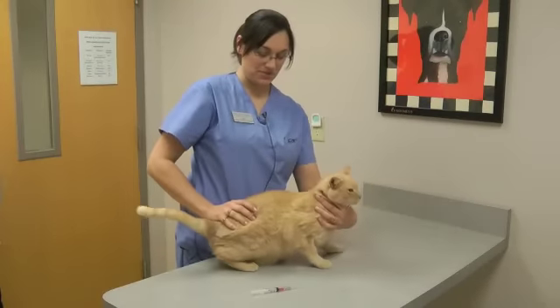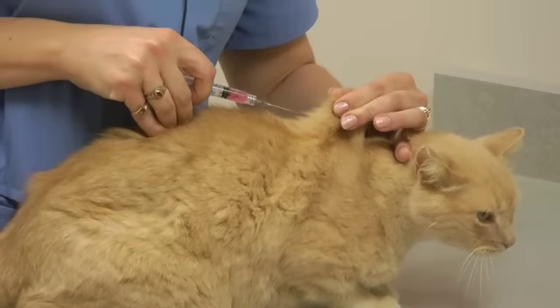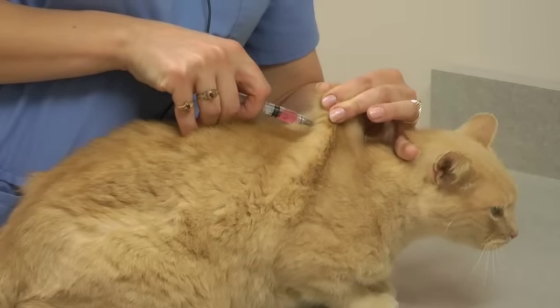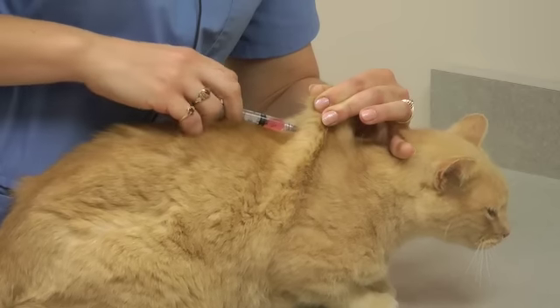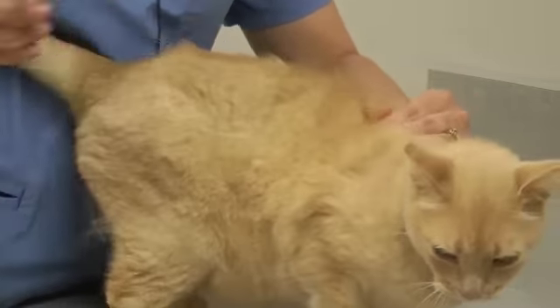The best place to do it is typically right between the shoulder blades because there's a lot of loose skin there. Expose the needle. Do it right in the middle until you pop through. Pull back just a tiny bit, make sure you're not getting any blood, and then push in the injection.